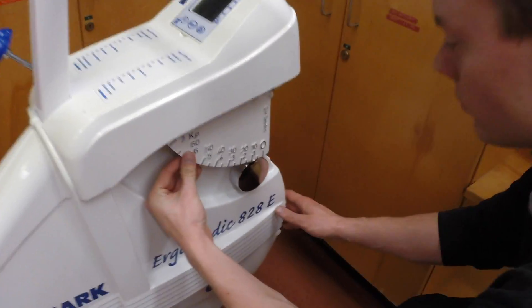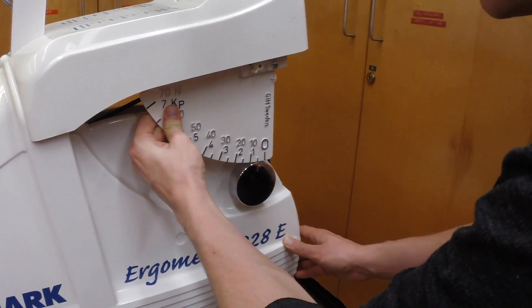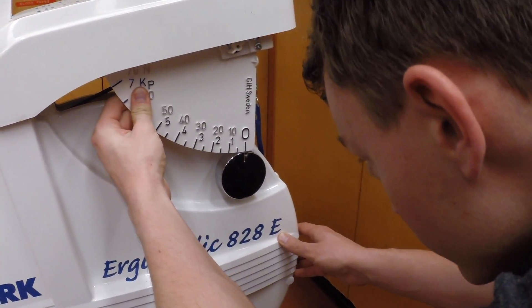Next, calibrate the cycle ergometer. Make sure the client's feet are off the pedals and adjust the gauge so that the marks line up at zero.